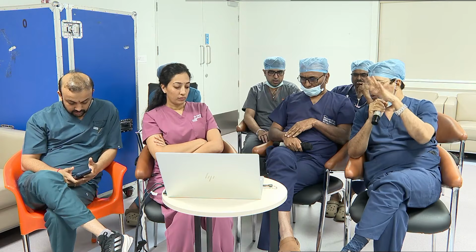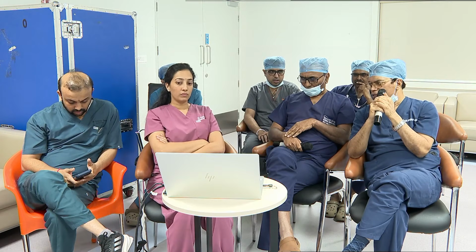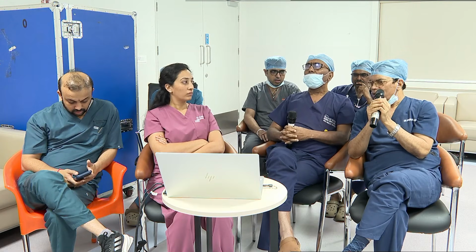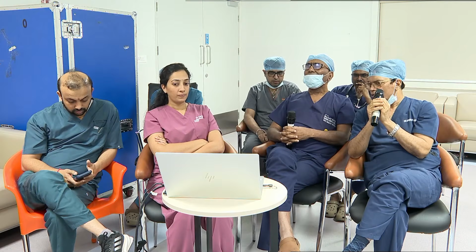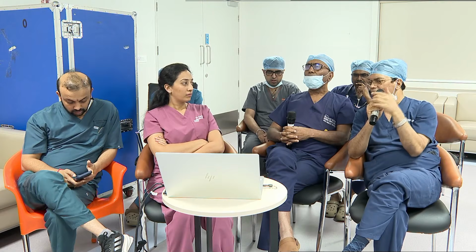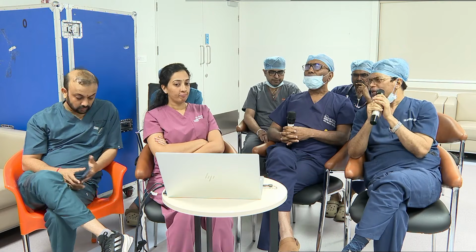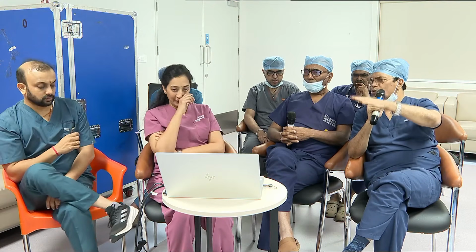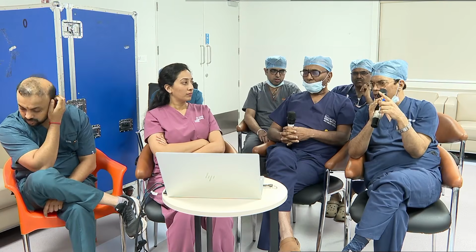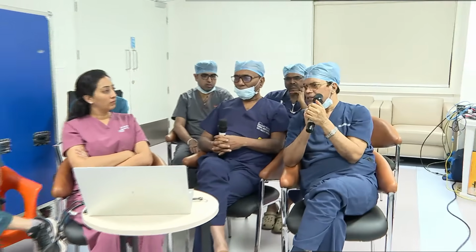Especially with complex coronary disease, you always decide whether to do TAVR first or this one. But if it is very severe, critical aortic stenosis, they always recommend the aortic valve first. Regarding coronary, suppose severely calcified tortuous vessels are there, I personally feel you first do the coronary, but mentally prepare. If something goes wrong, immediately you should be able to dilate and put the valve. But always try to tackle the coronary arteries if it is very complex coronary anatomy, very difficult to access.